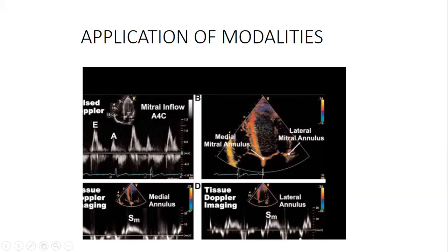That's why for pulsed wave Doppler, PRF must be at least twice the Doppler shift. Now, what do they mean? The PRF is the number of pulses that you are sending. So when you reduce your baseline, you also increase the rate at which you are picking the pulses coming. The frequency will increase because this is time, so the pulses will be closer together depending on the PRF that you've increased.